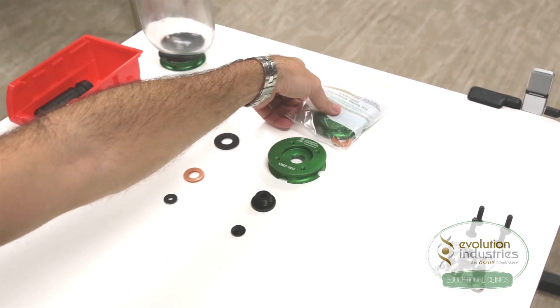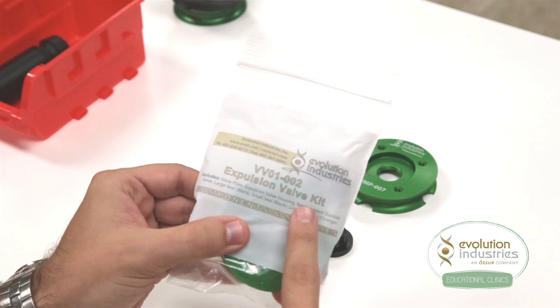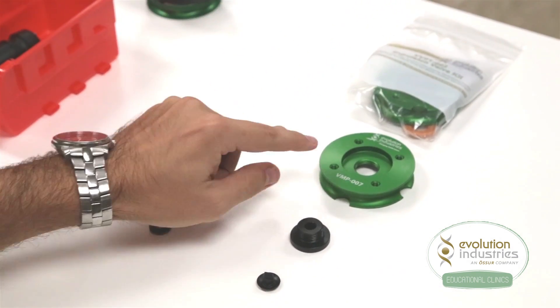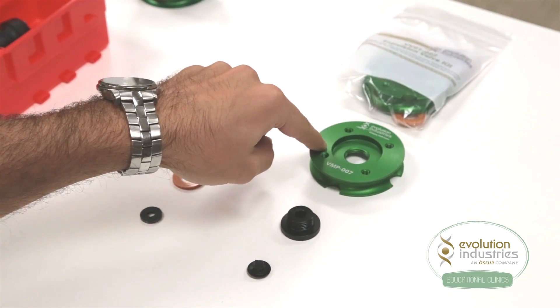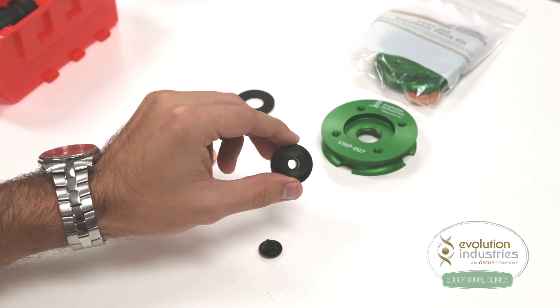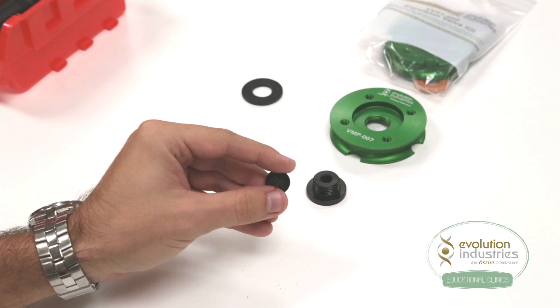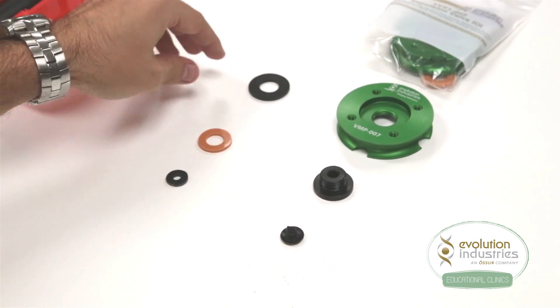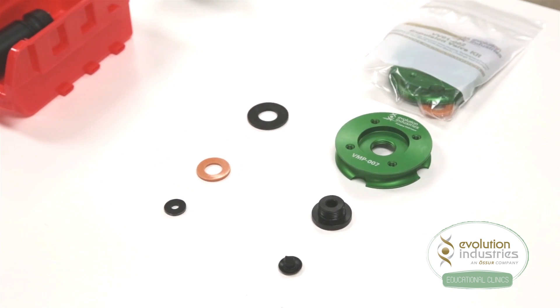An expulsion valve kit, part number VV01-002, has everything you need to set up this system. Specifically, you will use the valve plate, part number VMP-007, the expulsion valve housing, part number VV03-001, and the one-way duckbill valve, part number VV03-003. You will not use the large, orange, or small seal for this system.